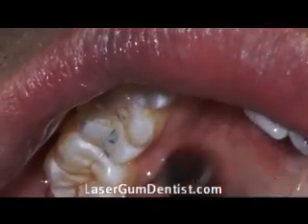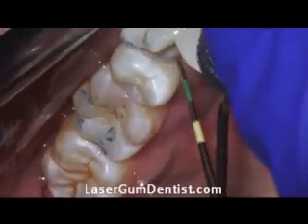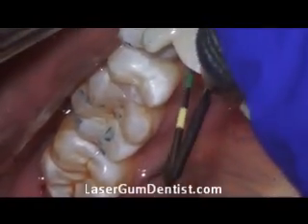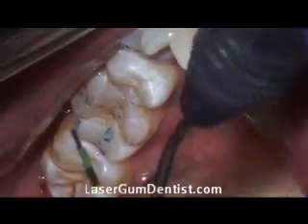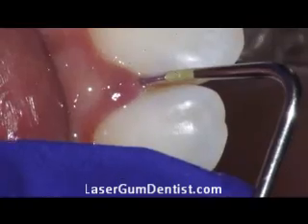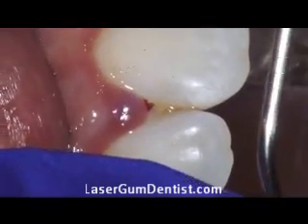If you look at that instrument it has different colors. Up to the first color it's three millimeters, then it goes to six millimeters, then to nine. What we're looking at right here is the after. This is the before. So you can see it just hits around six millimeters there and then about three.